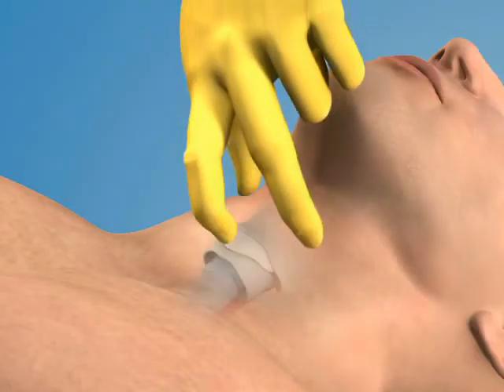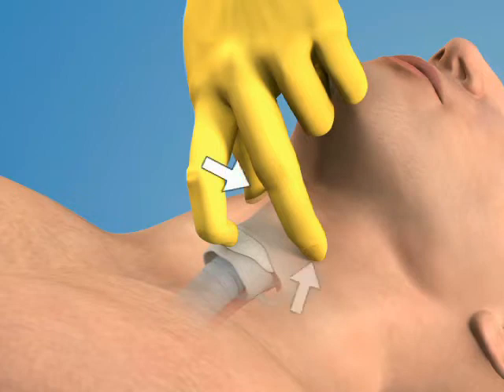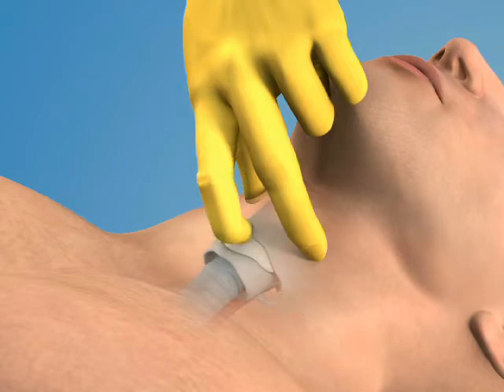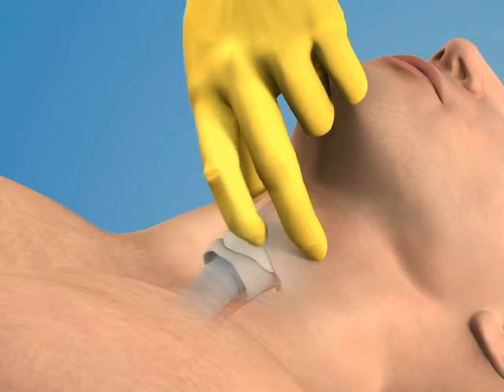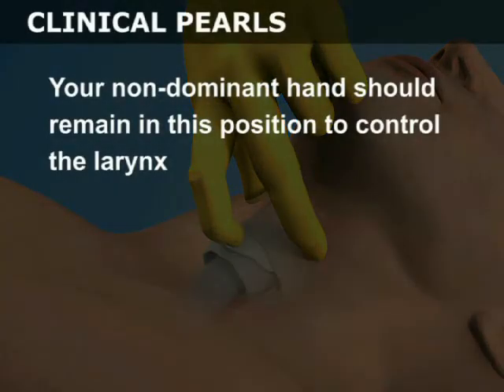Stabilize the larynx with your non-dominant hand by grasping the sides of the thyroid cartilage with your thumb and middle finger. Use your index finger to palpate the depression over the cricothyroid membrane. Your non-dominant hand should remain in this position to control the larynx.